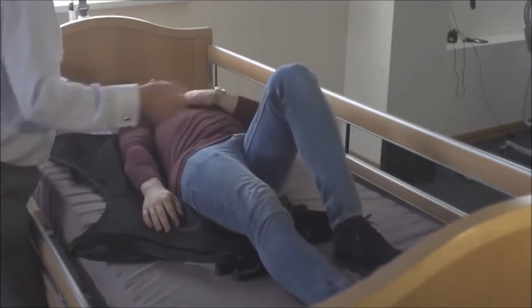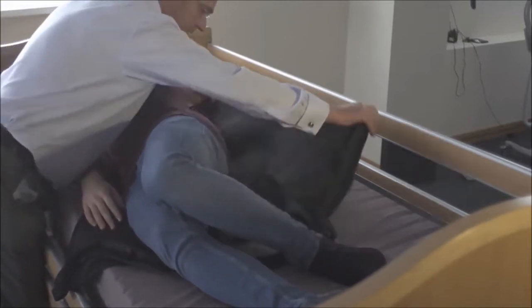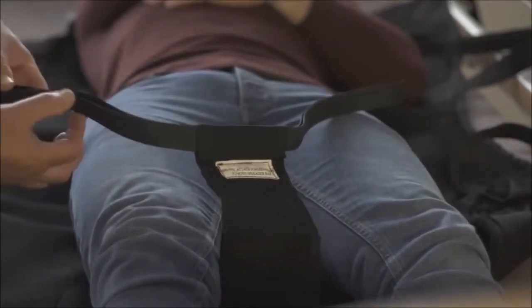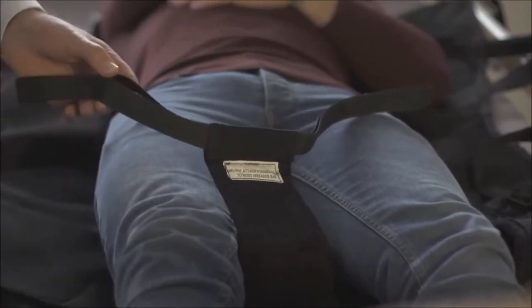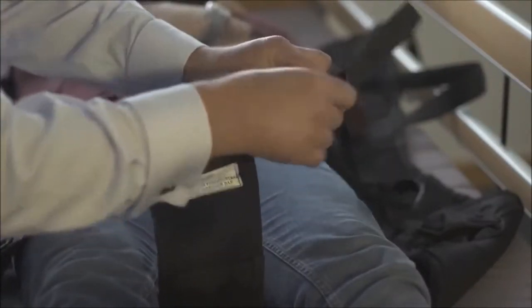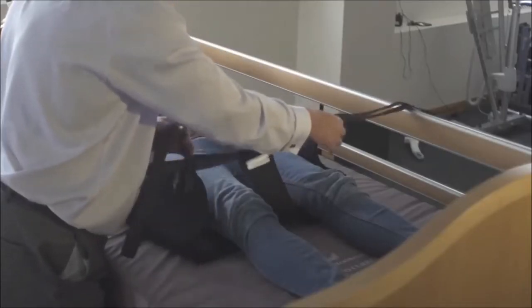Same again — raise that knee and if you could lean towards me, that's perfect. And if you lay it right down, that's lovely. So just bring the pommel between. Just got one loop here — took it through the outside and do exactly the same on that side. You've got two loop options and for Phil it's the first loop closest to the pommel.